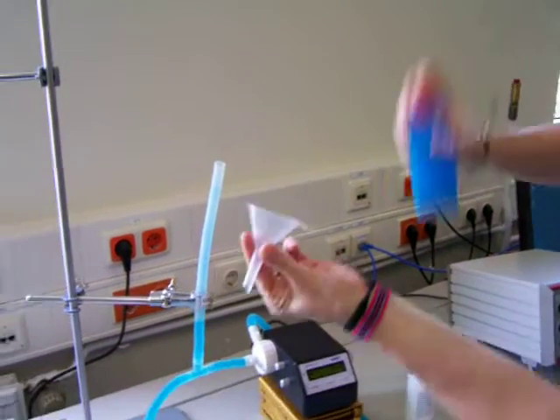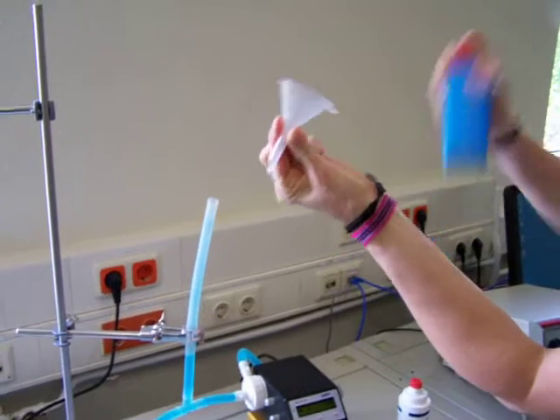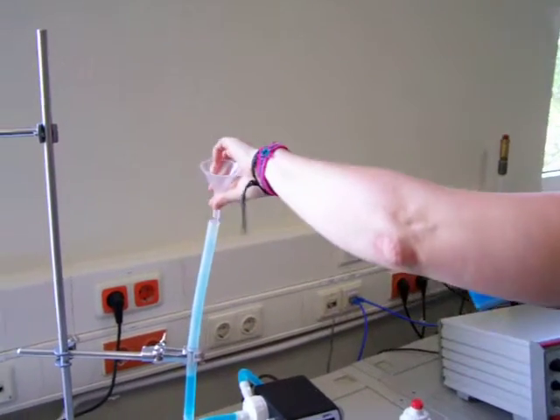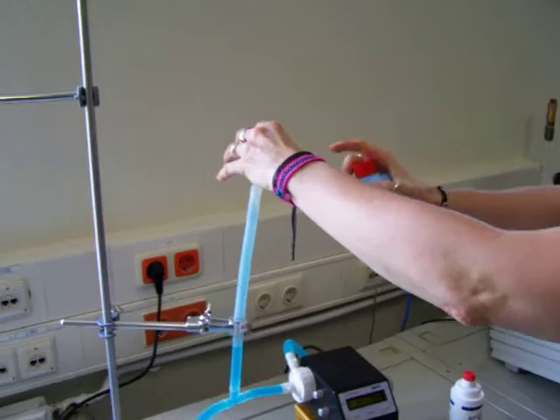If you fill it in with this little device here, this little tool, pour it slowly in so the air comes out.